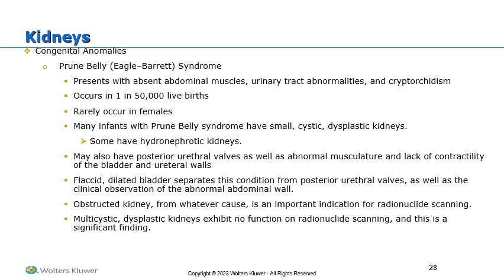In addition to this, if the patient were to have just multicystic dysplastic kidneys, they would exhibit no function on the radionuclide scanning, and that would be a significant finding. So when you have this group of issues and you're not really sure exactly what the cause of it is, radionuclide scanning in nuclear medicine is going to be very helpful in the physician making that final diagnosis.